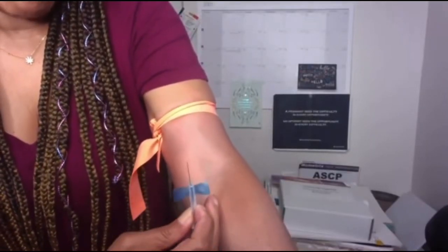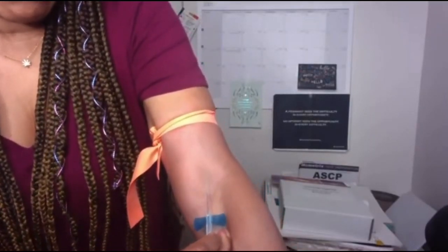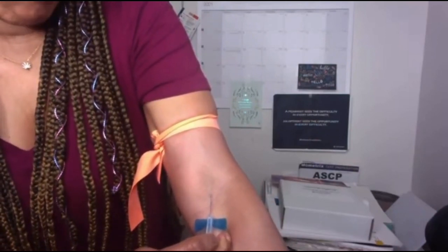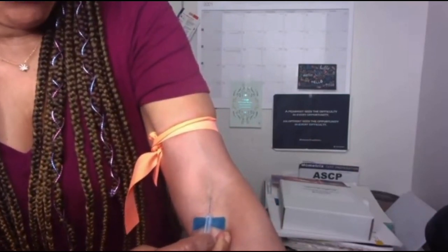Anchor. When I'm sticking myself, I anchor with my middle finger down. And like I said, give yourself room to maneuver.